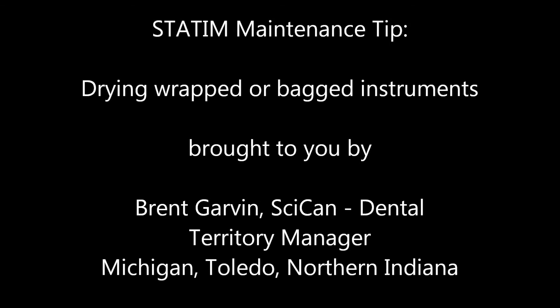Hello, Brent Garvin with SciCan Dental here with a helpful Statum maintenance tip. If your wrapped or bagged instrument loads are coming out wet after ample drying time, there are five things you can check to remedy the problem before contacting your local dental supplier for service.